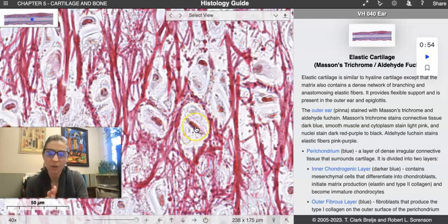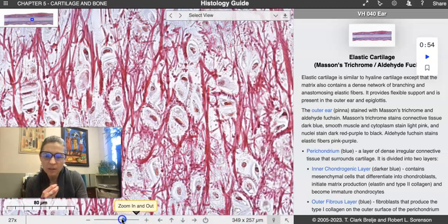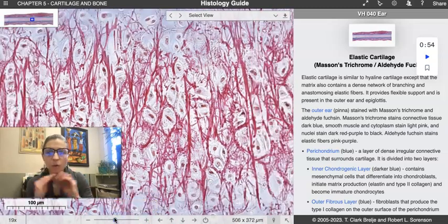The nuclei is pretty obvious to see. The cell would be filling up most of this chamber area. All of these cells are going to have a lacunae around them. And again, that lacunae is a space or a chamber around the cell. And so we'll see this as a consistent factor between cartilage and also with bone, that the difference between a blast and a cyte is the fact that the blast is actively making the substance. It's actively making cartilage or a bony matrix. And so the material it's making is butted right up next to that cell.